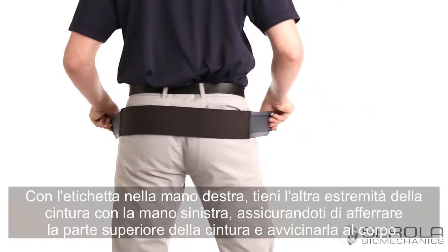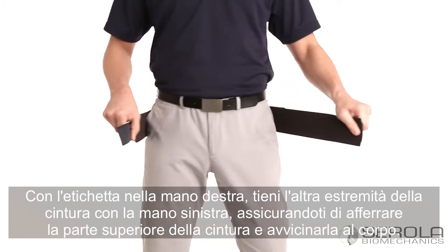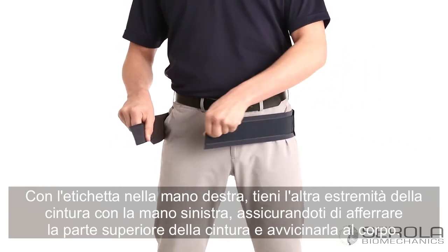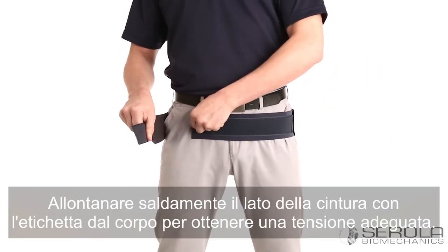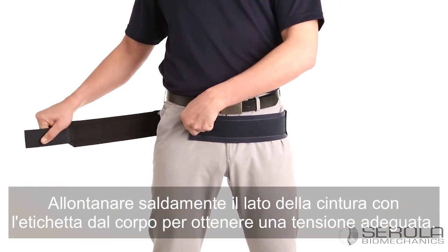With the label in your right hand, hold the other end of the belt in your left hand, making sure to grip the upper edge of the belt and pull it close to your body. Pull the label side of the belt firmly away from your body to achieve proper tension.